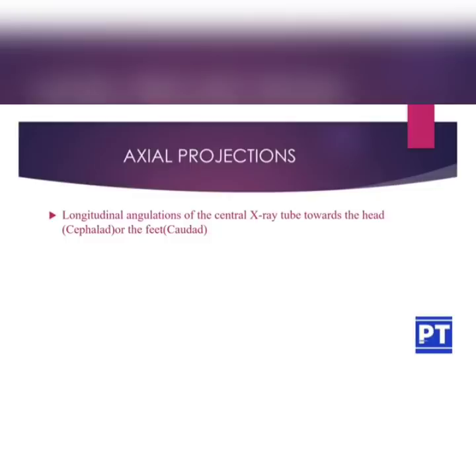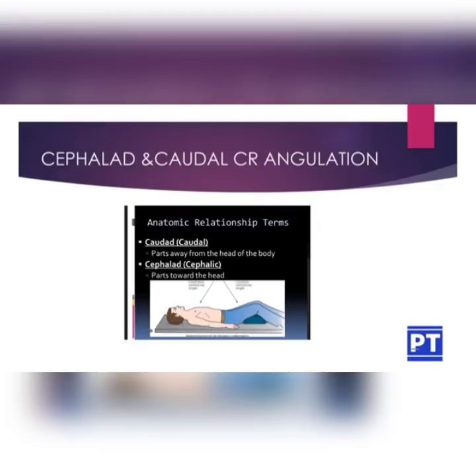Again, we are moving on to the axial projections. Longitudinal angulation of the central X-ray tube towards the head is known as cephalad, or to the feet is known as caudad angulation. This is an image showing the cephalad and caudad angulations.